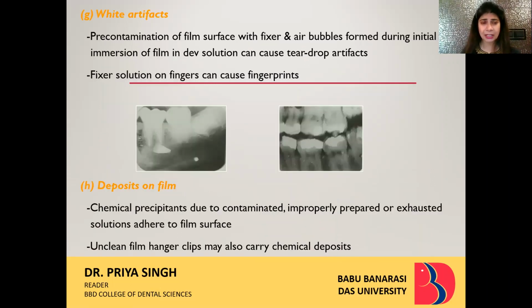Then coming to white artifacts, pre-contamination of film surface with fixer and air bubbles can lead to white artifacts. It's just the reverse of dark artifacts. There the pre-contamination was with developer. Here the pre-contamination of the film is with fixer.